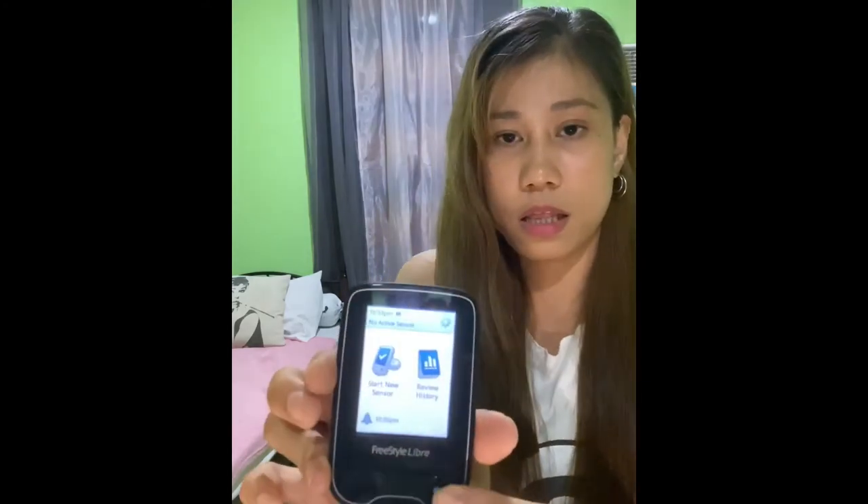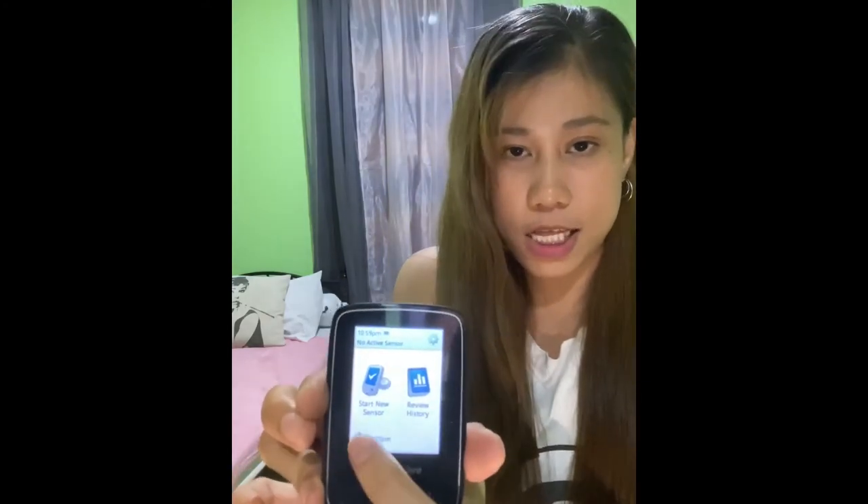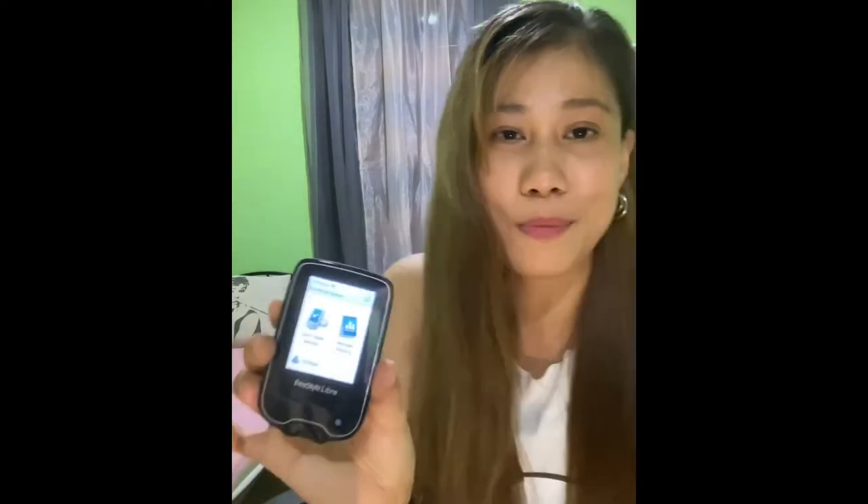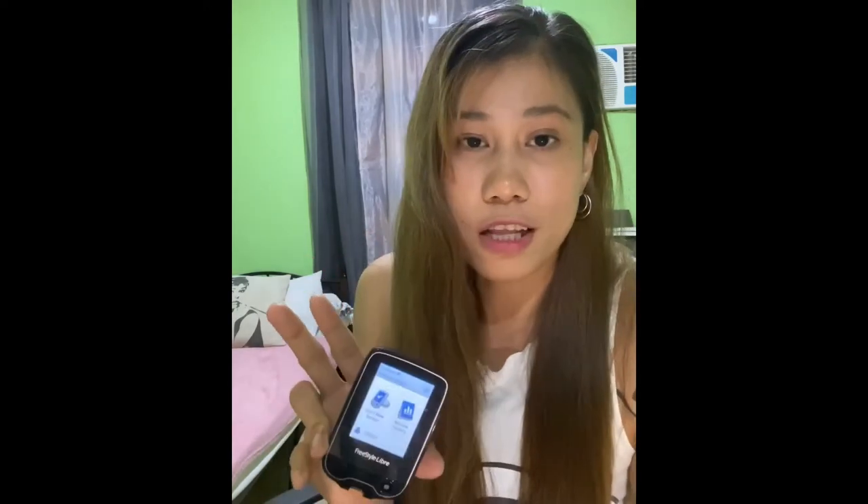So this is how a scanner looks like. It's a touchscreen. And today I'm going to start my second sensor.